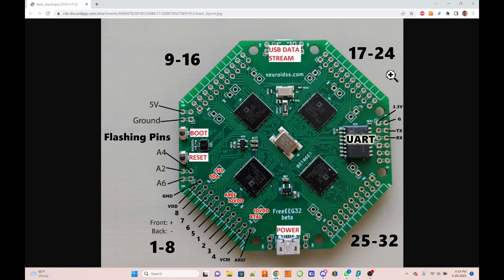Then if you wanted to, there is an isolated UART port here. So this big thing here, this component is another isolator, and that isolates the UART port. I believe though that this needs to be powered, and maybe this thing is 3.3 volt capable, but I myself use these ports here, and this thing needs to be powered with 5 volts, and so I actually have an additional little wire that I solder from the power supply, which is 5 volts, to power this system here, because this is isolated from the rest of the board. But only do stuff here if you really know what you're doing. If you're just connecting a headset, then now all the information is there.